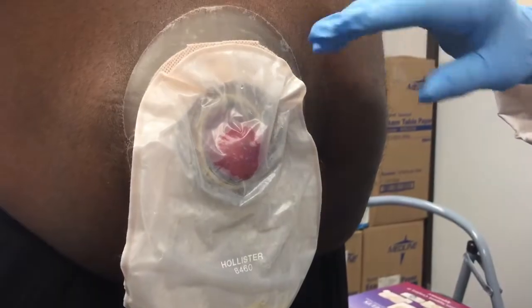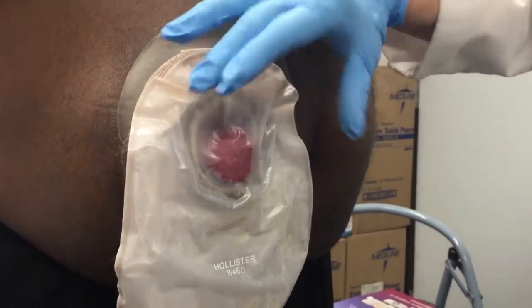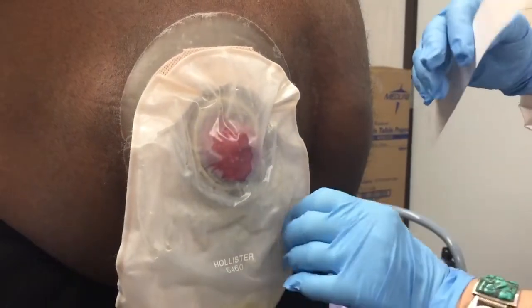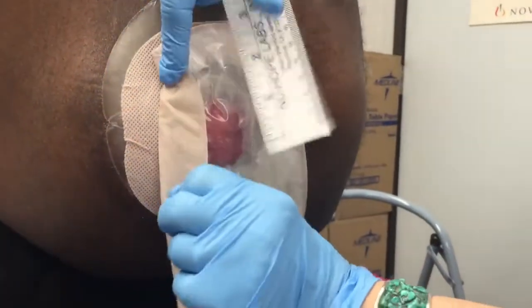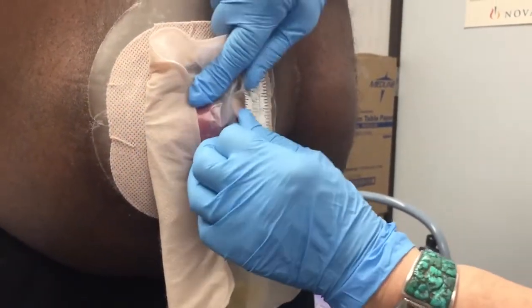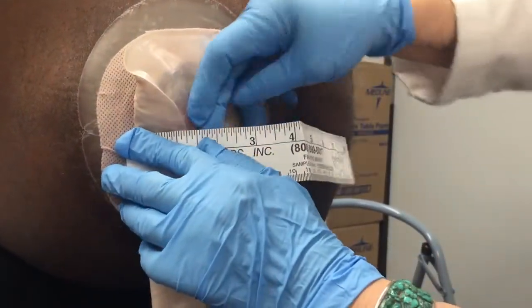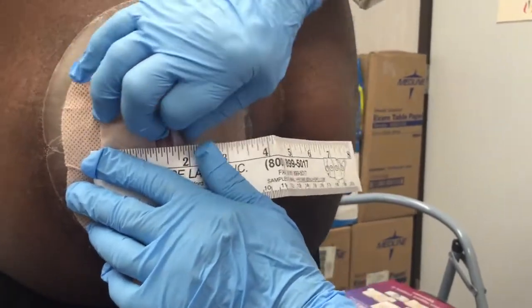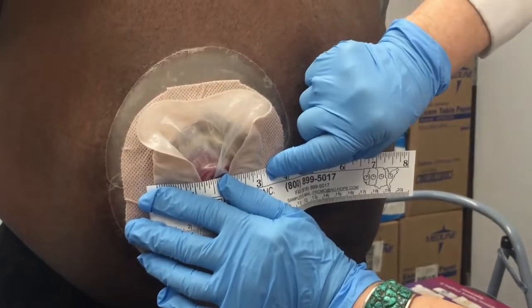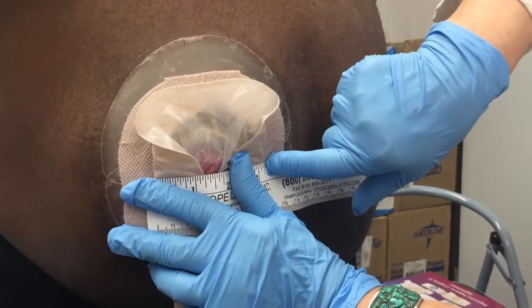It's important to get the correct size opening for the belt so that it's not too snug around the pouch or not too large so that he's going to be bulging way through. With a one-piece type pouch, you're going to fold the bag over to where you hit the weld line on both sides, and measure from the weld over to the weld, giving it a little tiny bit of space — so it's going to be a three and a quarter inch opening.